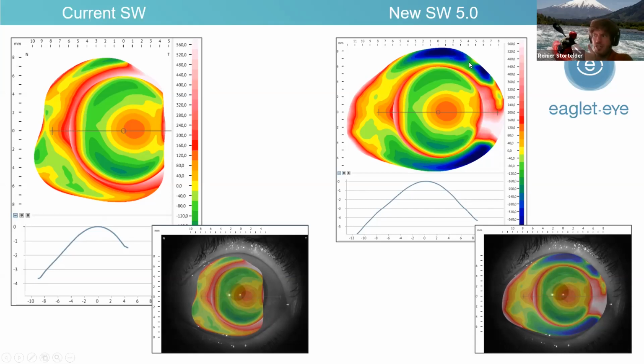Now we capture everything on that side where it was blocked by the ring before. The only problem still remaining is the eyelids. So still, we will keep saying it: yank open the eyelids.